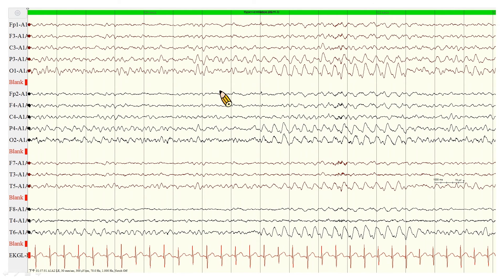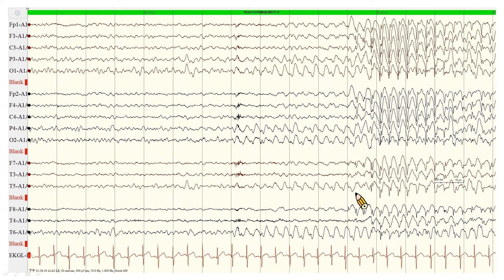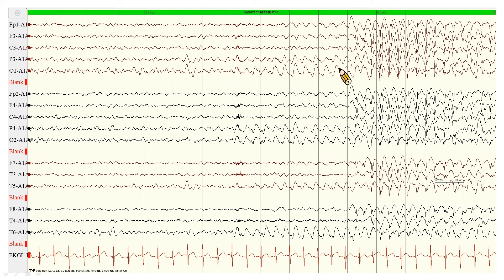In this A1-A2 montage EEG, we can see rhythmic delta waves over bilateral occipital areas. Changing to double banana montage, we can see some sharp components over the delta activity. The patient is under hyperventilation. After continuing to read the EEG, the rhythmic delta activity becomes rhythmic generalized spike-and-wave complexes. This is a patient with absence epilepsy, provoked by hyperventilation.